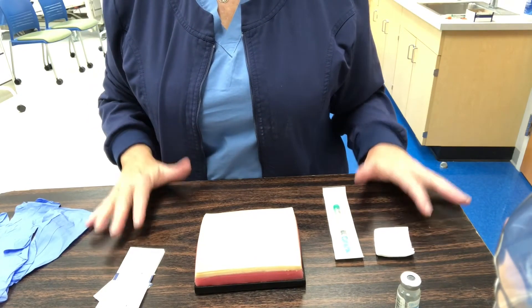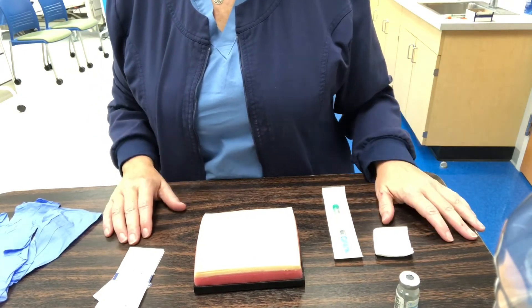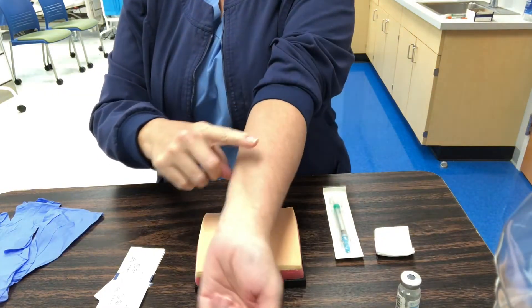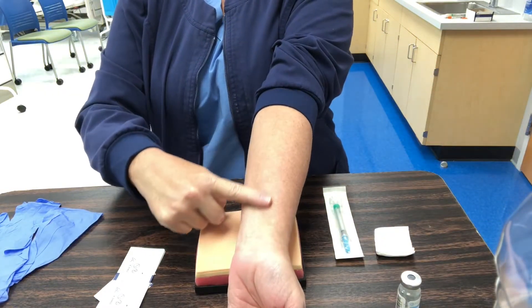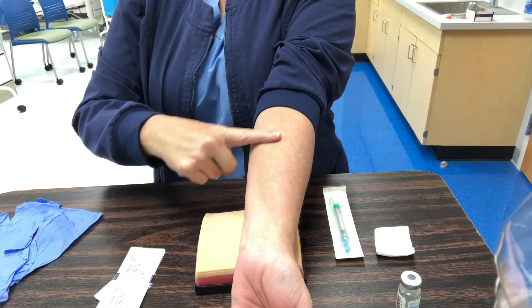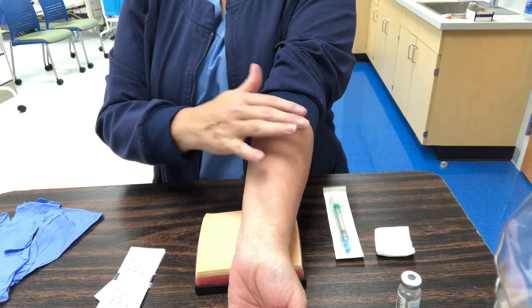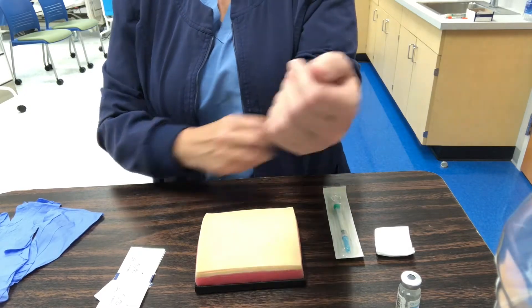We want to expose the inner arm for an intradermal injection. Normally when we're giving an intradermal, we'll give it right into this area right here. We'll have exposed that and we're going to clean it with an alcohol wipe.